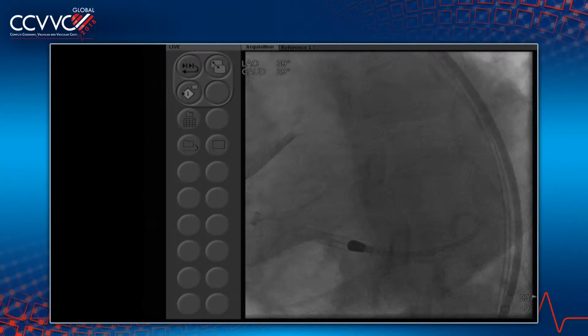When you have an EDP of 36 and you are doing multivessel PCI, invariably, if your PCI goes as planned you'll come out fine, but if anything goes wrong during PCI, this guy will go into flash pulmonary edema on the table requiring intubation. So since the EDP is high, I would definitely say in this case support with Impella is very important. Antonio has a comment, and I'd like to hear from Raj Makkar as well.